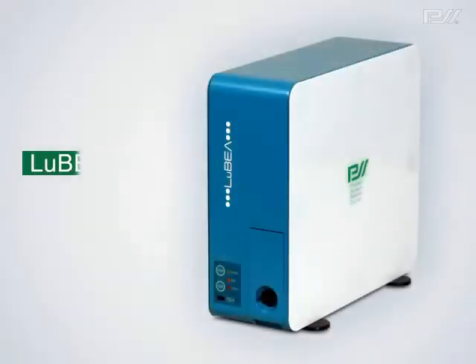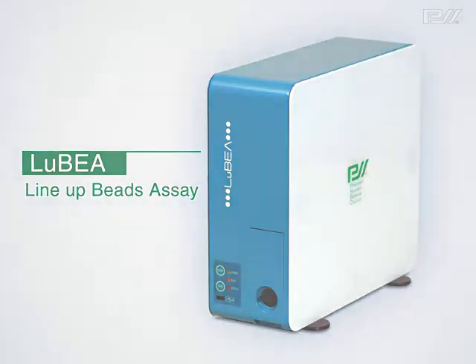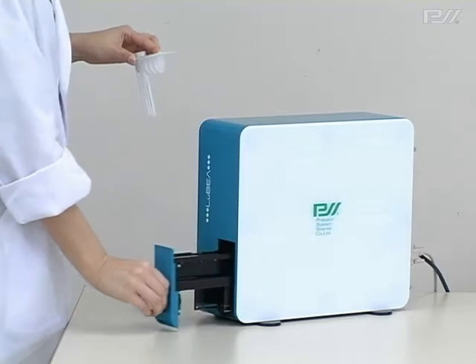Next, I will describe a new compact system to handle the BIST device known as Lubia. Lubia is fully equipped to handle all operations from sample handling, reaction, washing and detection through to analysis. Using immunoassay as an example, I will describe the Lubia system.